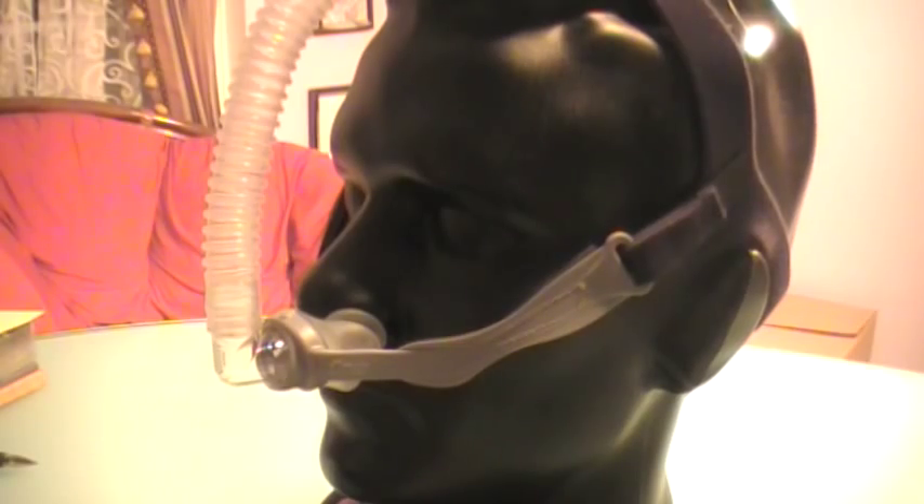This is a fabulous mask. As of January 17th, 2011, of all the nasal pillows out in the market, this one consistently provides the best results with the least amount of complaints from my patients. This is truly one of the best CPAP nasal pillow systems around.